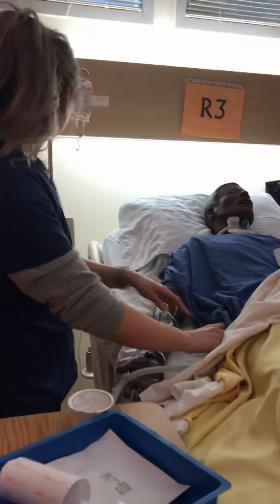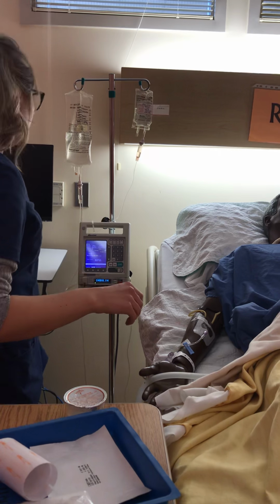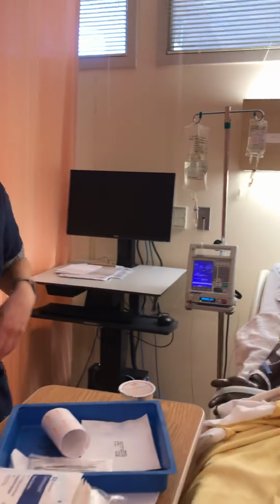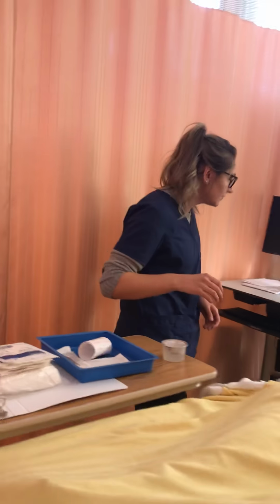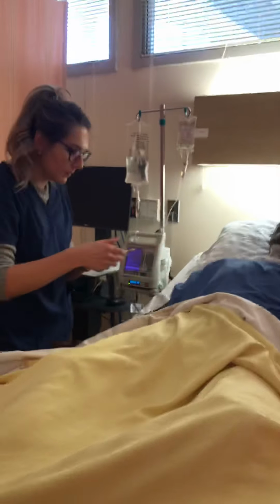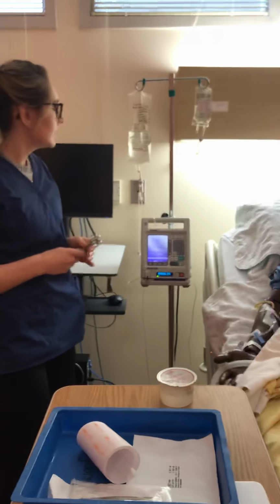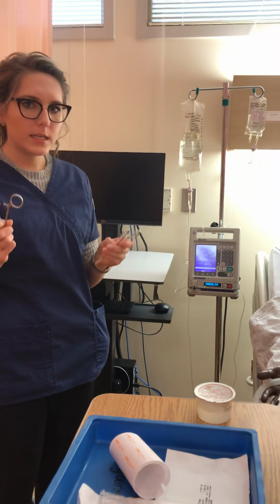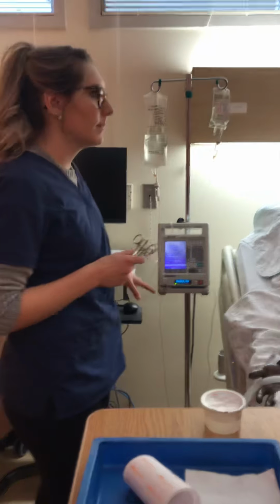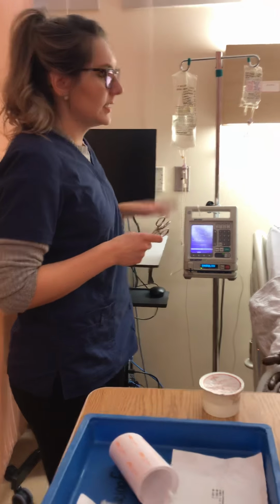So right now what I'm going to do is I'm going to take my little forceps here. Where are my clamps? I'm just going to look for my clamps here. They should be part of my safety kit. Oh, they're down here. Okay, so they should actually be hanging up here, as well as my safety container. My safety container includes these, and I'm going to make sure that it includes my normal saline as well as my tape and gauze.